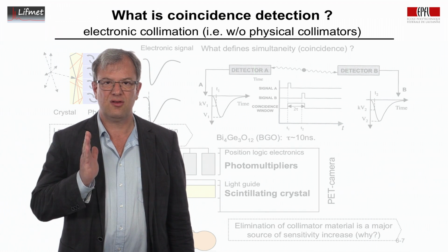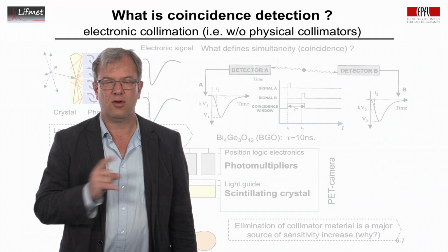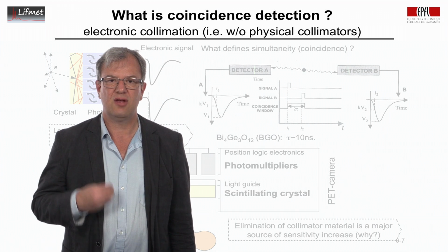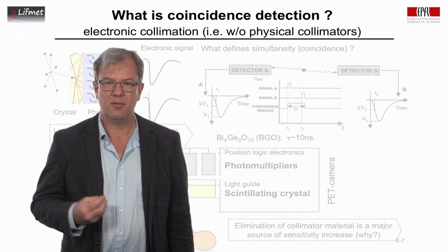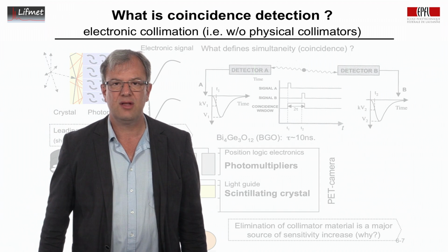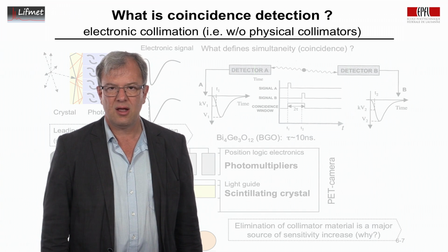We just basically put a material in place that blocks the X-rays that do not satisfy our geometric condition of collinearity. So what we're doing is we're taking X-rays and we're eliminating the bad guys with the wrong geometrical arrangement. So collimation is a process of establishing directionality by eliminating all the X-rays that are not coming in perpendicular to the scintillation crystal.